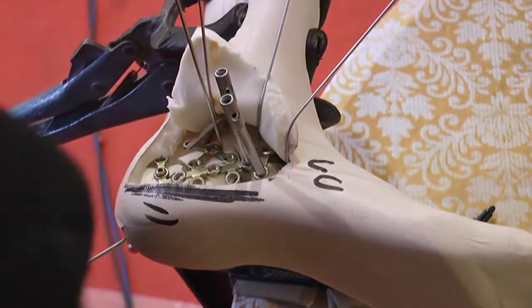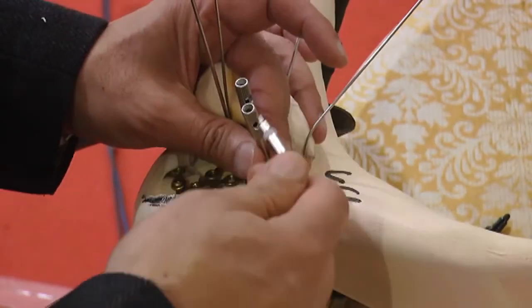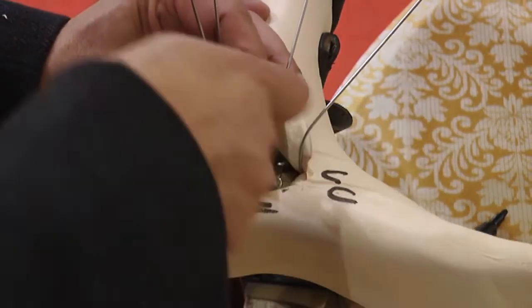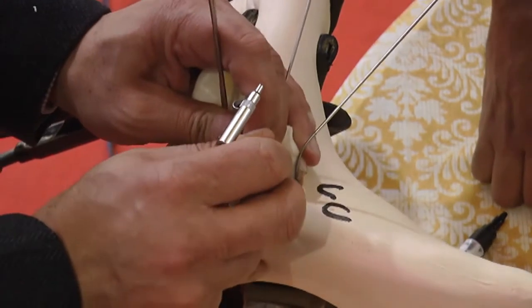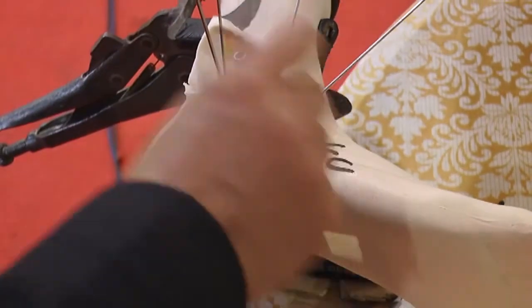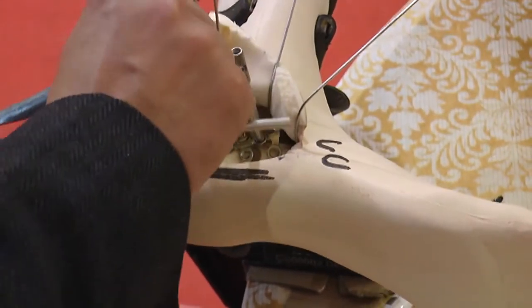Can we have something to tighten this? You can tighten the locking towers with a mosquito. With a mosquito, tighten them fully, and you can use these towers as benders of the plate. So it is possible now. If I do this, you see the plate has gone down here. So this plate is fairly malleable, and each part can be individually bent, changing the locations of the locking towers wherever you want to bend them.